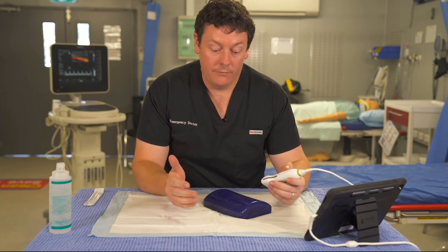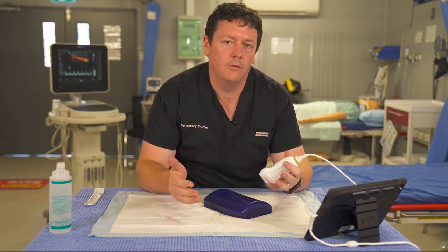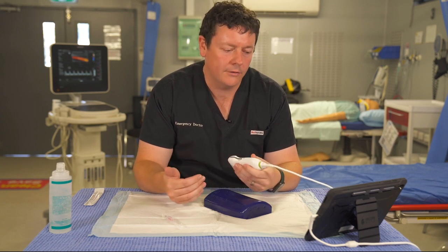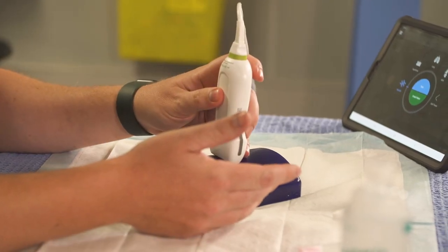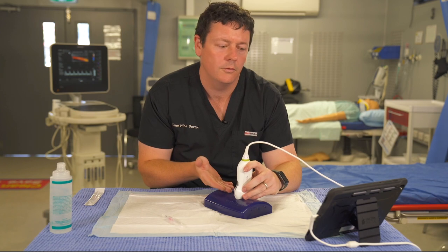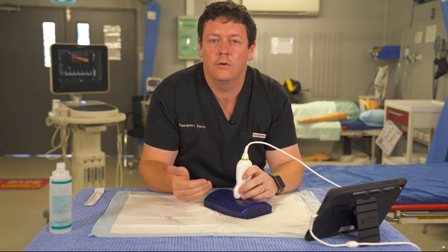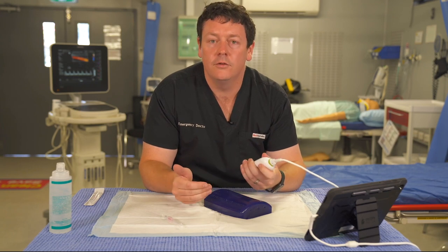When doing vascular access or any needle guidance, the way you set up your ultrasound machine in relation to where you are sitting is very important. One of the most common mistakes I see registrars make is trying to insert a cannula or do central access with the machine in an ergonomically awkward spot. For example, if the screen is right in front of you, you can simply look there while keeping the patient in your peripheral vision. If the screen is off to the side, you end up looking under your own arm — so make sure the setup is comfortable for both you and your patient.